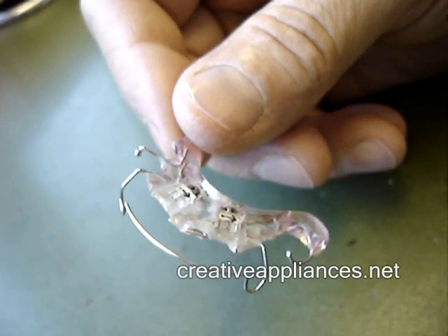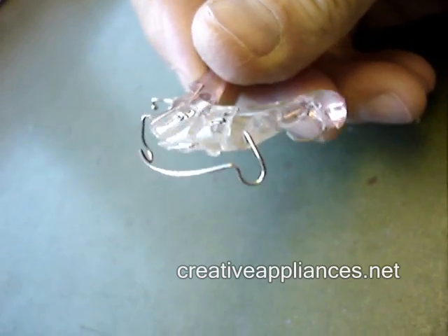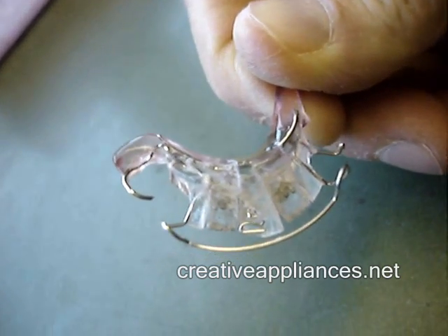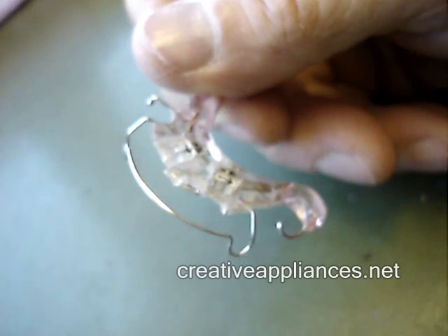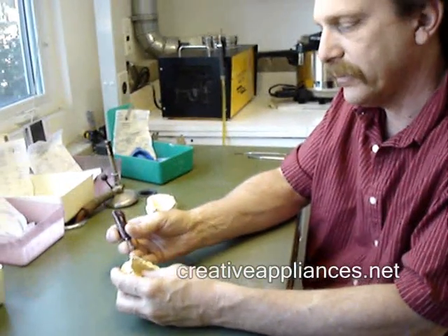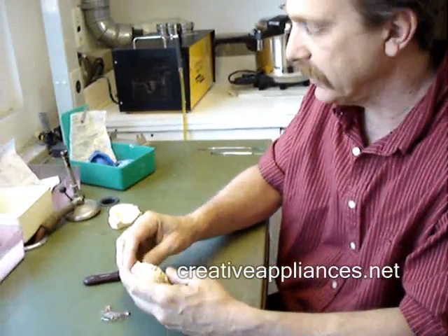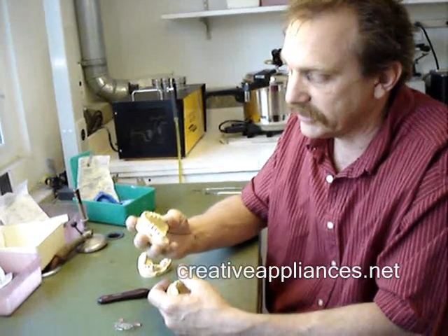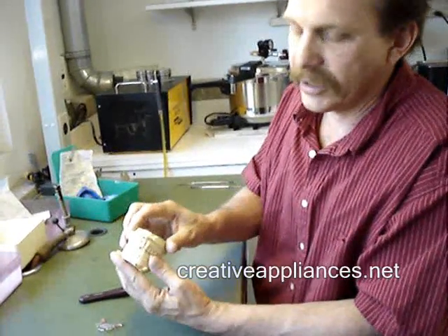This appliance was done for a 31-year-old female who has already had the maxillary arch done. This is a mandibular appliance, and what we're attempting to do — and will accomplish — is to use her natural teeth rather than compromise the natural enamel. She's got nice teeth, so there's no reason to reduce these and make crowns or veneers when her natural teeth are perfectly fine. As you can see, she's already had the work done on the upper arch. Everything looks very nice and lined up very nicely. She's got a really nice smile, and now we're working on the lower.